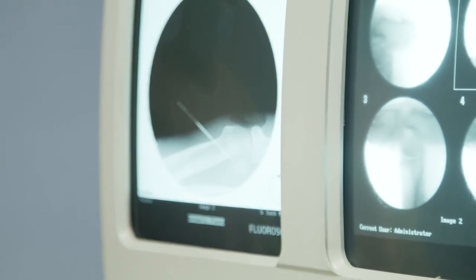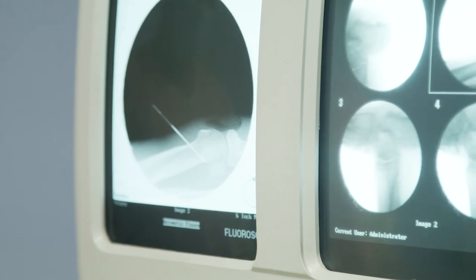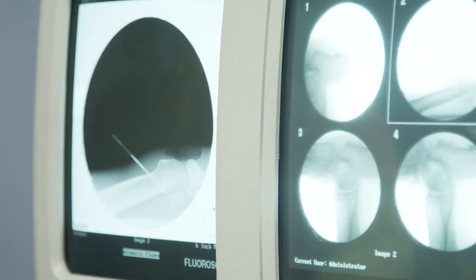You see the bump on the bone. Okay, that's where the ulcer is, right beneath the bump. And then right where I have my marker, that's where we're going. Okay? We're in business.